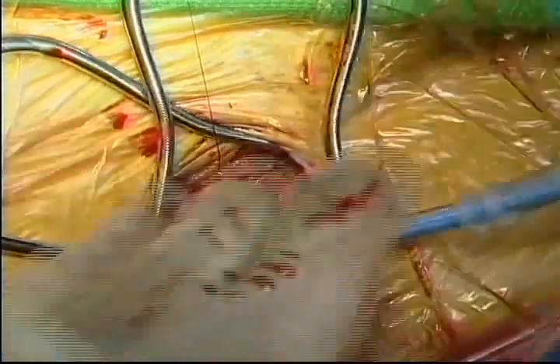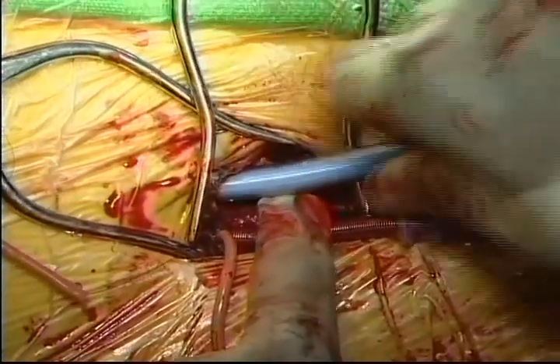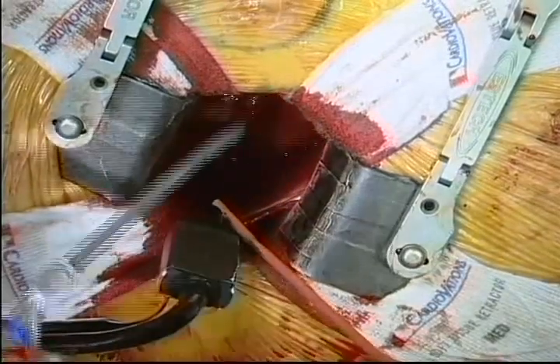With this secured, attention is turned to venous cannulation. With echo guidance, the venous cannula is advanced over a guide wire into the superior vena cava. Both antegrade and retrograde cardioplegia are used. The retrograde catheter is placed with echo guidance.